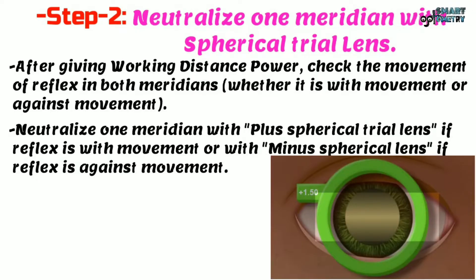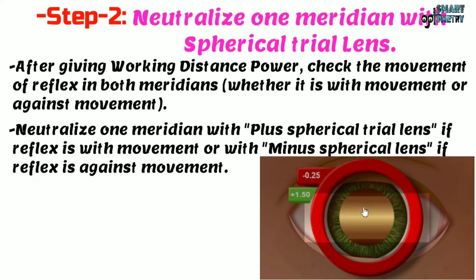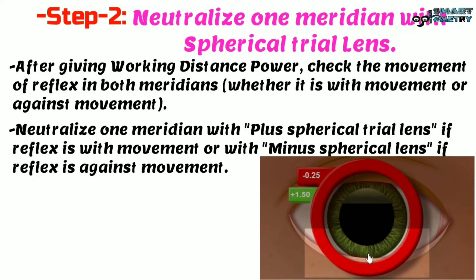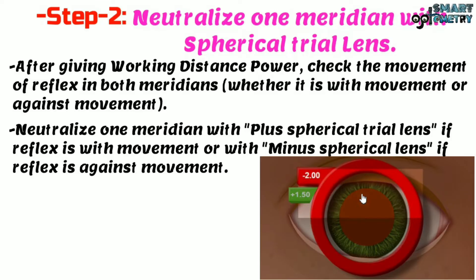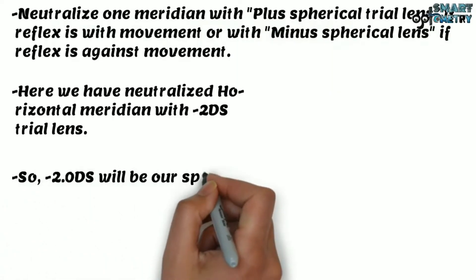Now we will neutralize one meridian with spherical trial lens. Let's try to neutralize the horizontal meridian. In horizontal meridian we are seeing against movement, so we will place a minus spherical trial lens. Starting with minus 0.25, it's still against movement, so we increase the minus power in steps of minus 0.25. After incrementally increasing the power, the meridian is now neutralized. We have neutralized the horizontal meridian with minus 2 diopter spherical trial lens, so minus 2 diopter spherical will be our spherical power.